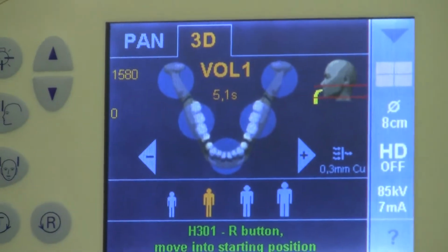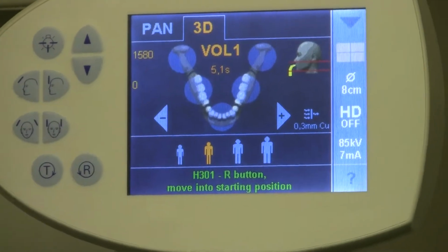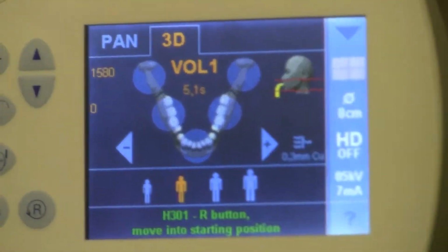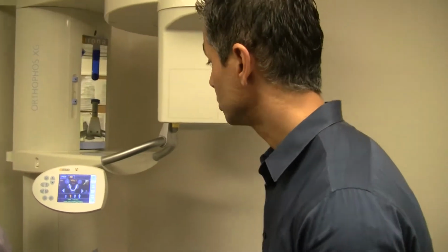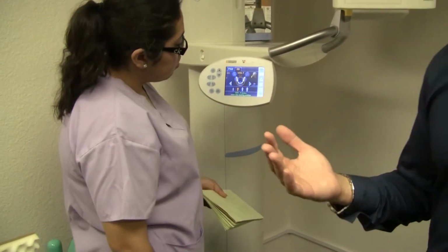So let's suppose we want to take an x-ray on the doctor in the anterior, okay? Three-dimensional, that will be 8 by 8. You'll be surprised, with the 8 by 8 in the anterior, it covers molar to molar. It covers third molar to third molar. So go ahead and select that, if you will. So right here? Yep. See, now it lit up, right?